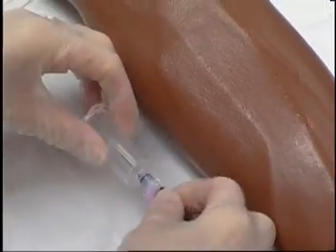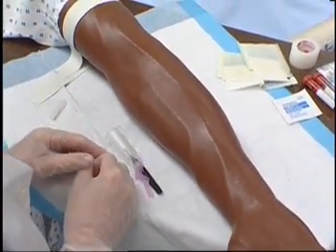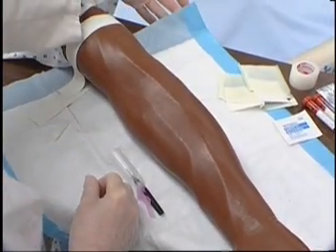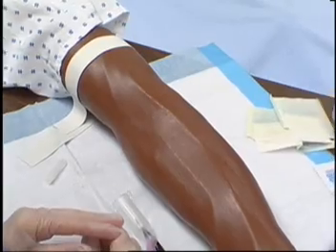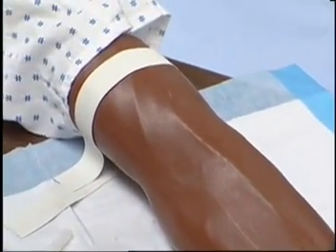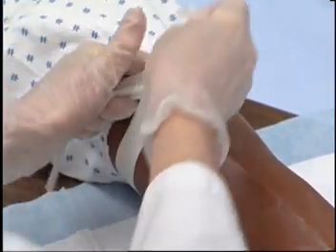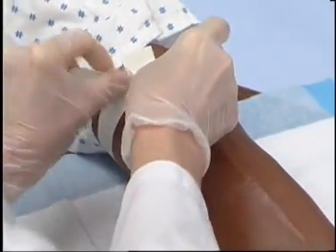Place extremity straight and in dependent position if possible. Place absorbent pad or towel under arm. Place equipment close to work area. Place a tourniquet four to six inches above the site selected. The antecubital fossa is most commonly used.